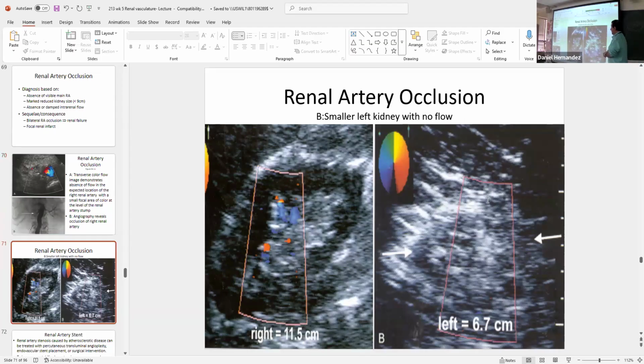Again, if you don't see the renal artery and then you move out to the kidney and you're imaging your kidney, the right kidney measured 11.5 centimeters. We put our color on, we still see some flow. This patient probably has disease on both sides because we're not seeing much flow out in the cortex, just primary flow in the central medulla of the kidney.